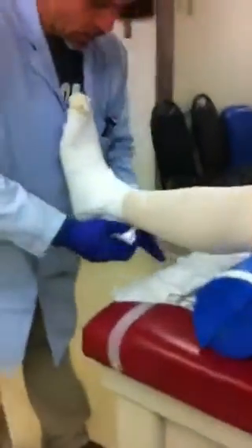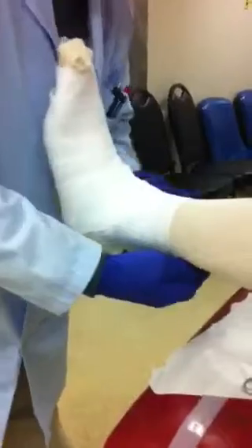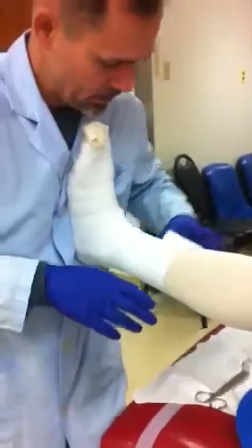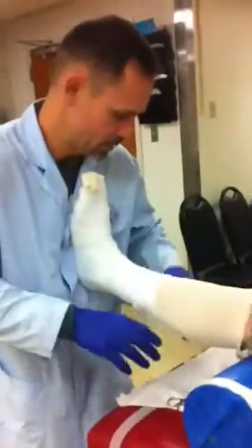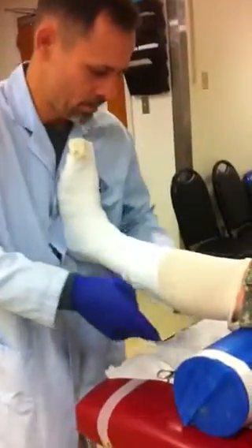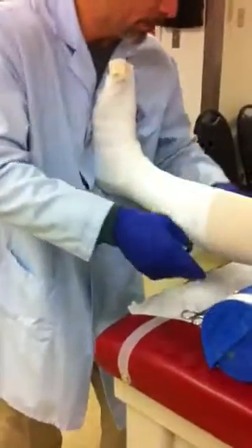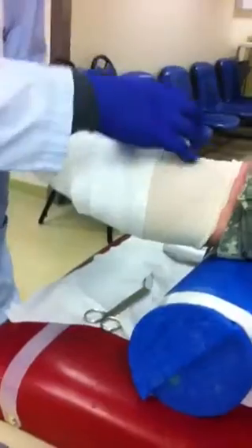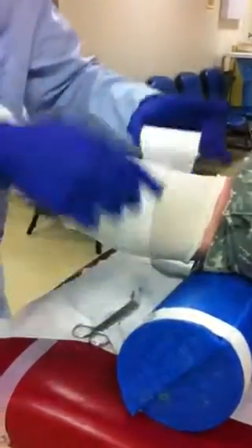This is the second layer. This is what we call a web roll — it's just a roll of cotton. We have to be very careful in the way we wrap this as well — no bumps. It can be rolled very tight because it will rip before it causes constriction. It smells when it gets wet.